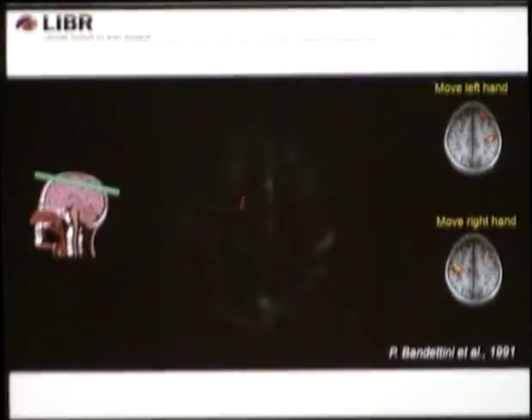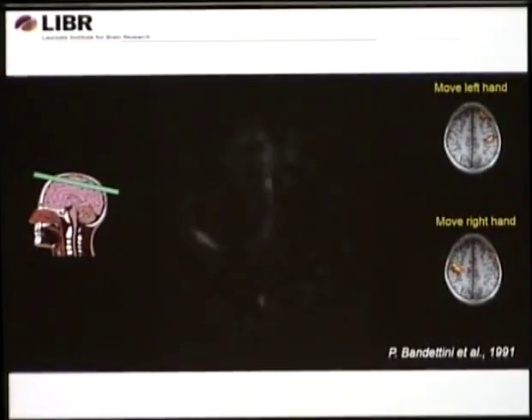College of Wisconsin in 1991. So this was the first observation in humans of fMRI-induced task activity during essentially finger tapping. So the subject was inside the MRI machine, and as I told you, we make the movie from his brain. We select the part of the brain, a slice like this, a little bit, we call it oblique because it's angled, which covers the motor area, which I was showing you before.